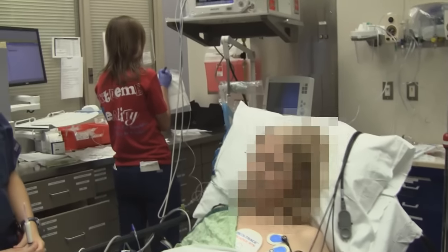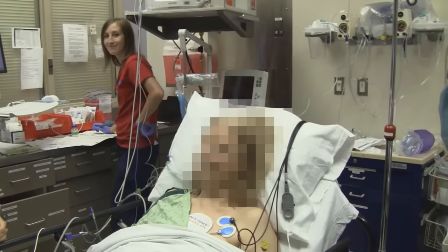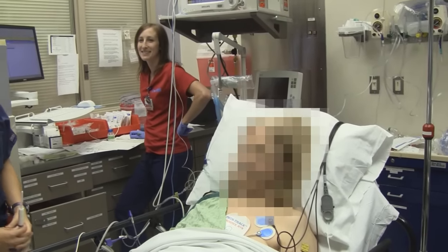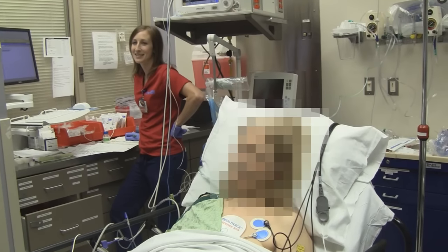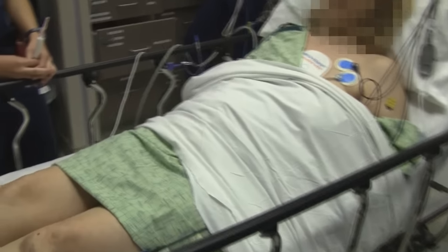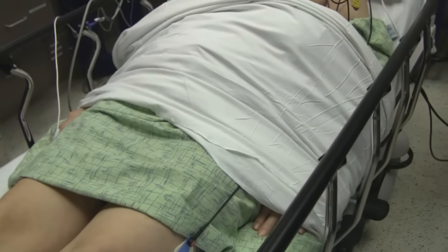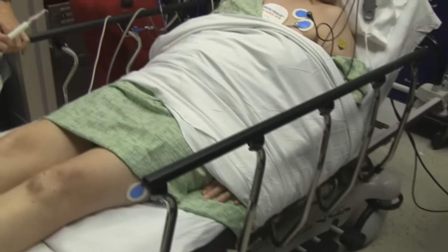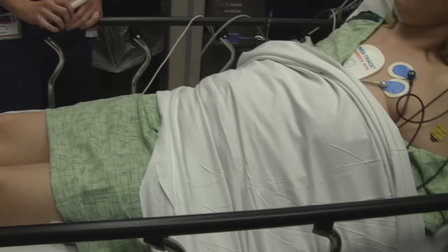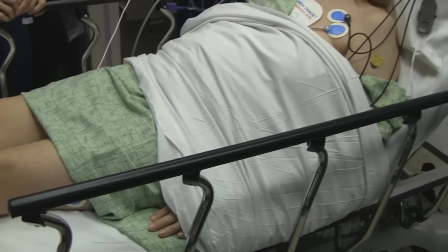Our cardiologist is standing here at the bedside leading and directing this procedure. Do you have any words of wisdom? One learning point is we like to tuck in patients' arms gently, so that when they're cardioverted the arms don't bump up, which minimizes the risk of hand or finger injury on the side rails. So we're going to tuck you in snugly — not too snug.